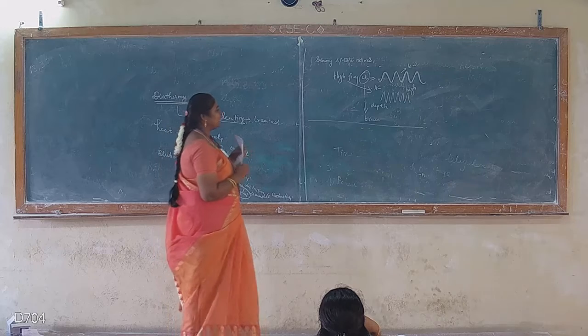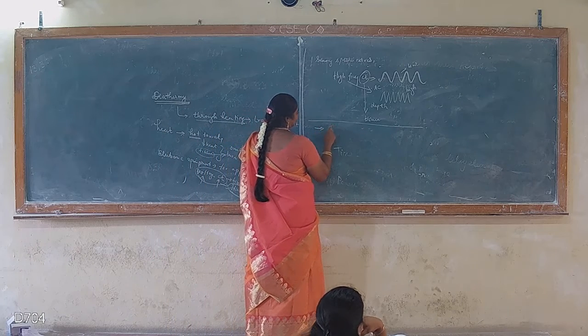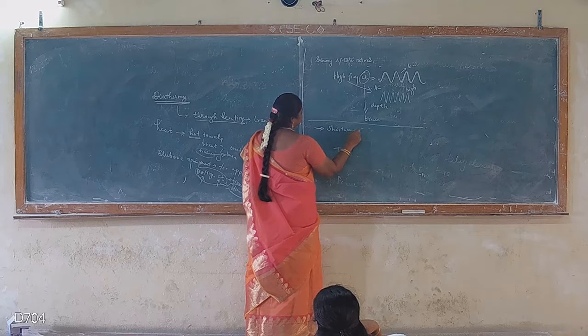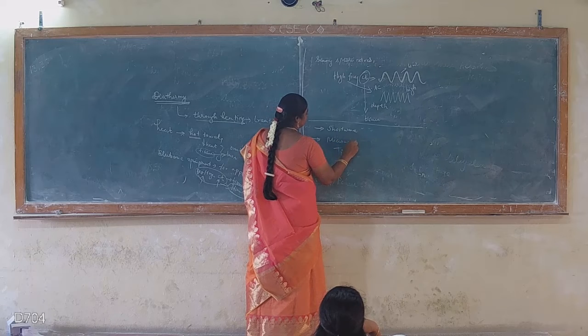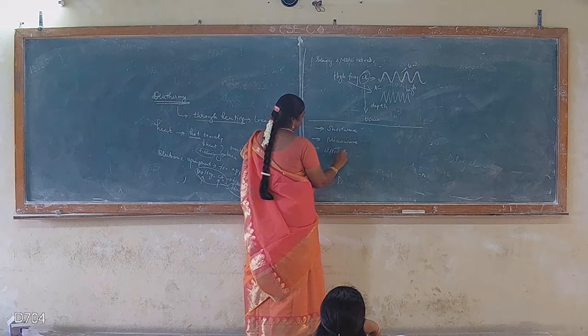Now the diathermy techniques are classified into three types. The first one is shortwave diathermy, the second one is microwave diathermy, and the third technique is ultrasonic diathermy.